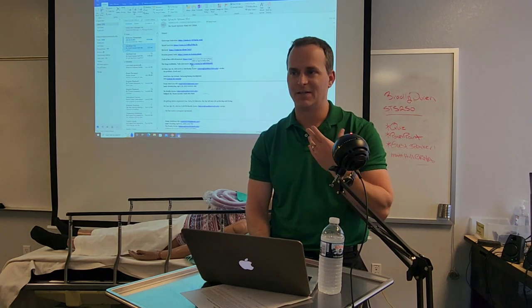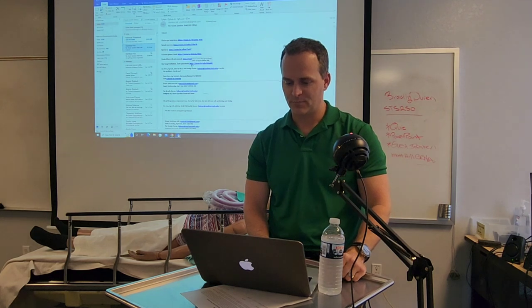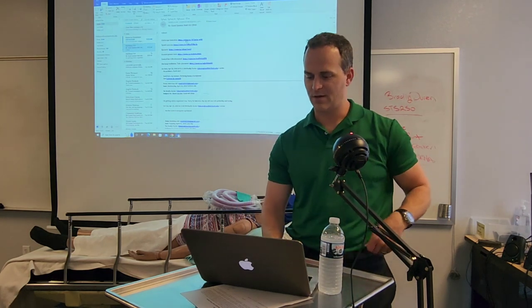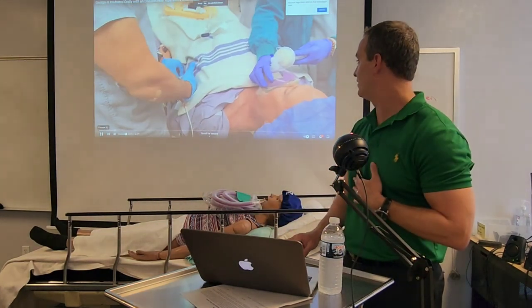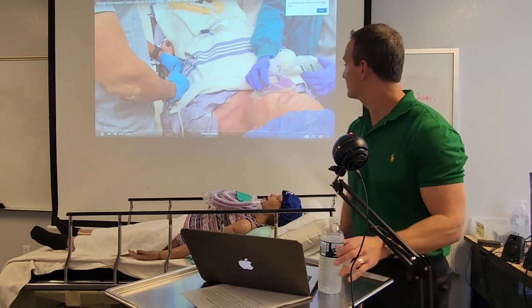We can also deliver the anesthetic gas through a tracheostomy, which sick patients with cancer in their larynx might have. So we've got a video on actually intubating a patient. That's our first video. All these videos are short, just so we can kind of move through the topics. But if you guys have any questions about what they're doing, feel free to ask.